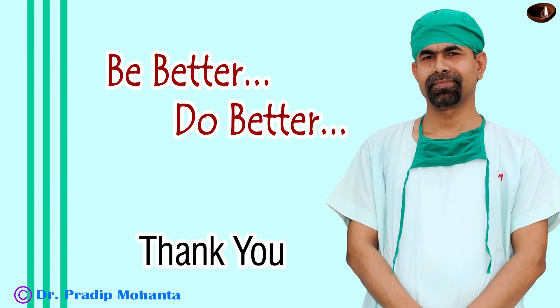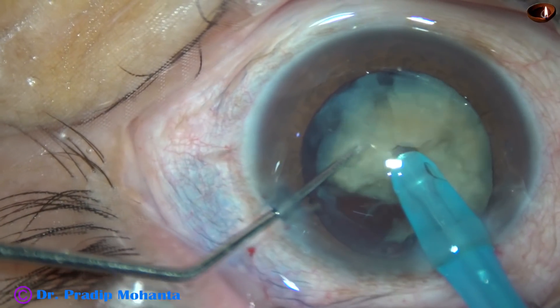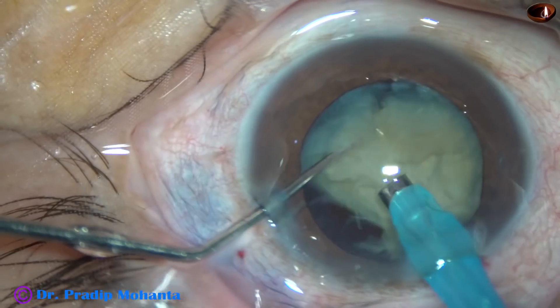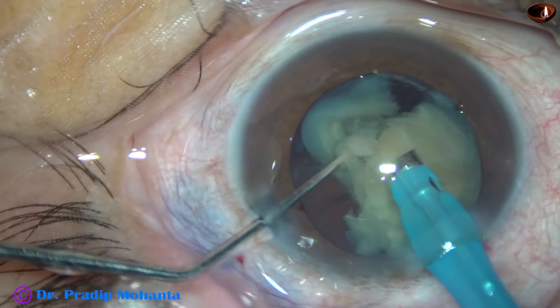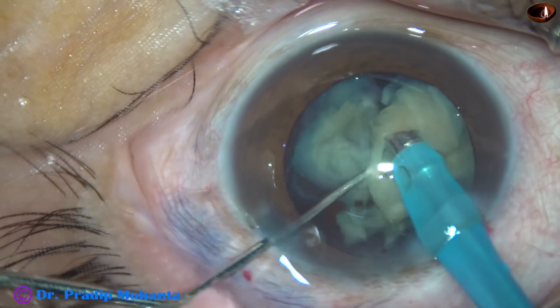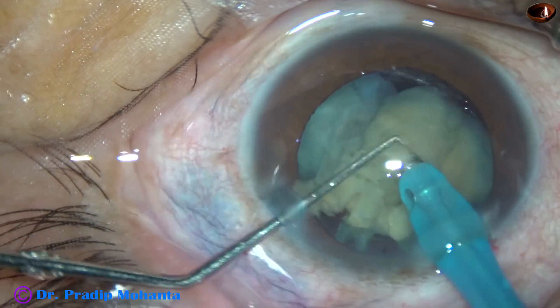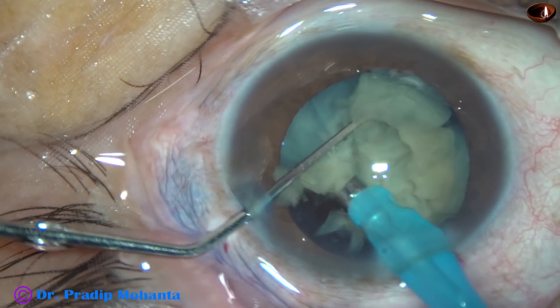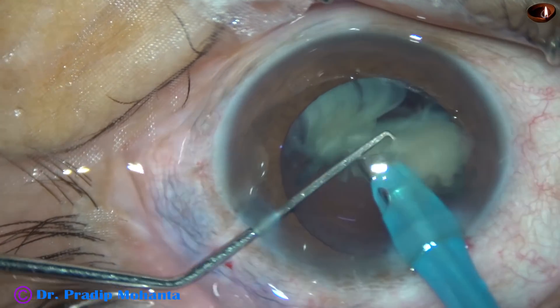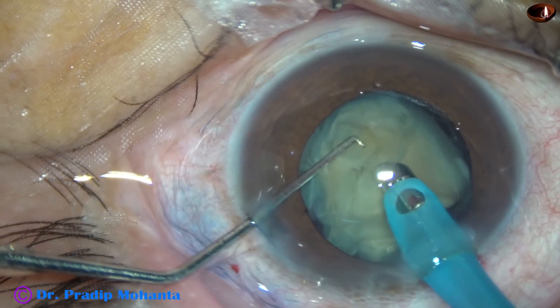Thank you very much for your attention. So, whenever there is a leathery posterior plate which is too stubborn to give in, we have to be very patient and slow the phaco particularly during the last stages of surgery. We can peel off the epinuclear shell from the nucleus and use the epinuclear shell to protect the posterior capsule for some time. The thing is, we must take utmost care at every step of surgery to get the best possible outcome.